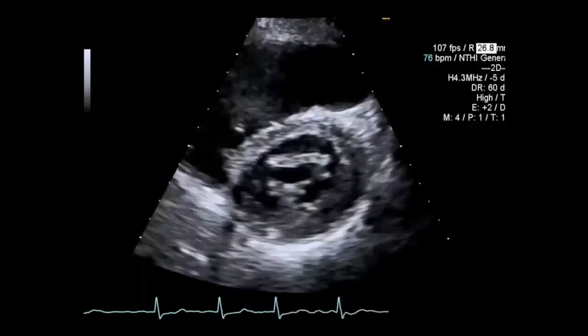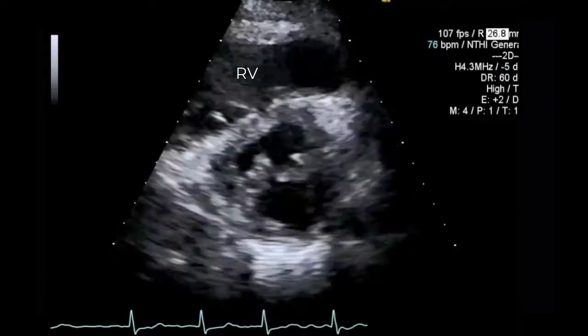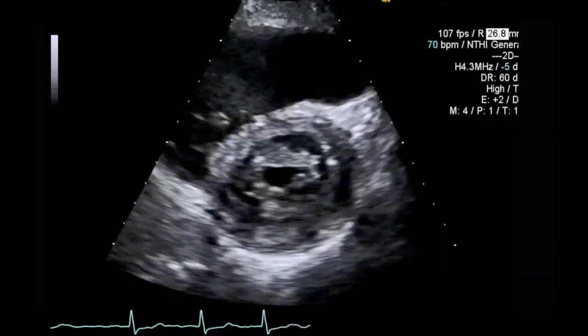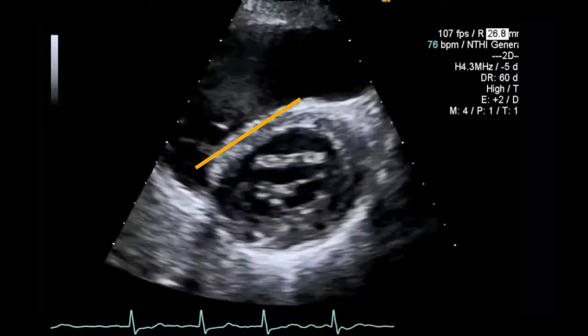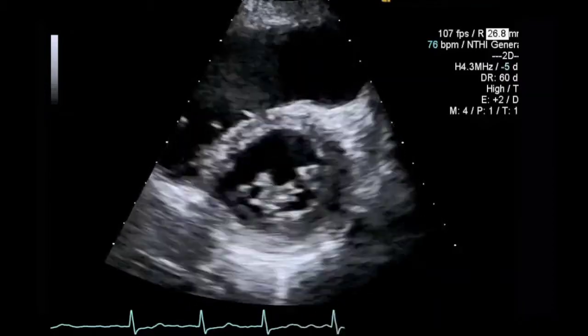This is a basal view of the LV in short axis. The RV is severely dilated. The septum appears flattened and the LV cavity has a D shape in diastole and systole. This is caused by acute RV pressure and volume overload. This could well be a patient with an acute pulmonary embolism.